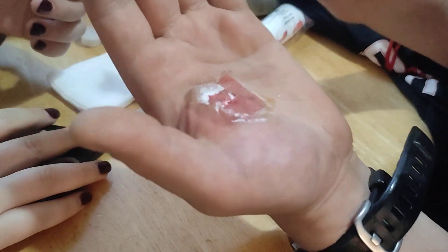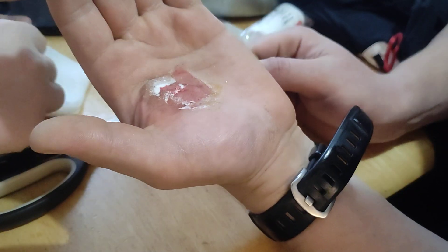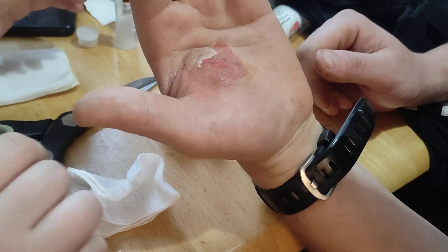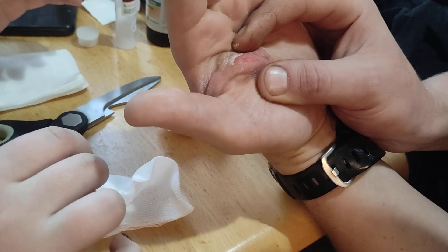Let's see if it's not bleeding — just to be on the safe side. I don't even know where it is. Is it there? Don't touch it, please. Should we glue it on top of this one? It's antibacterial, so there is no problem with gluing it on top of it. Where is the end and where is the start? It's from here to here. So you can hold the glue.